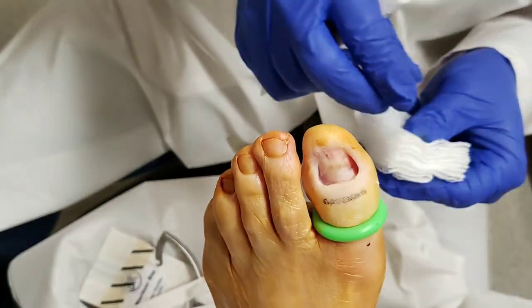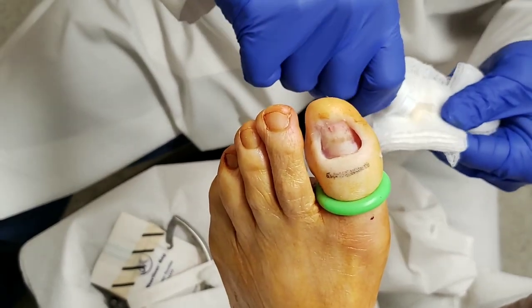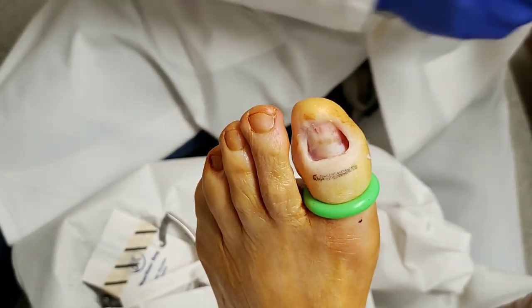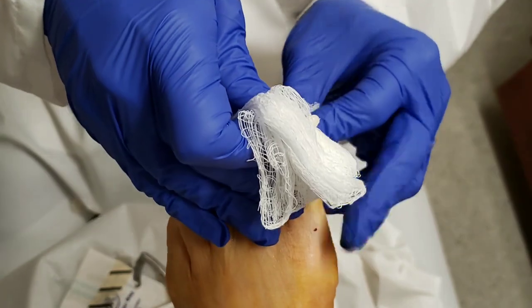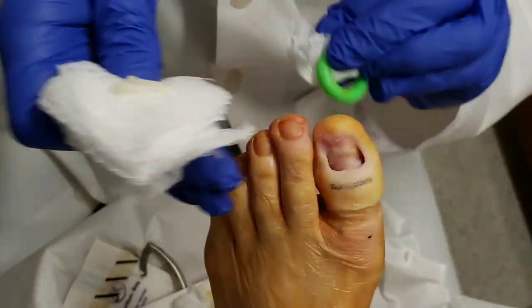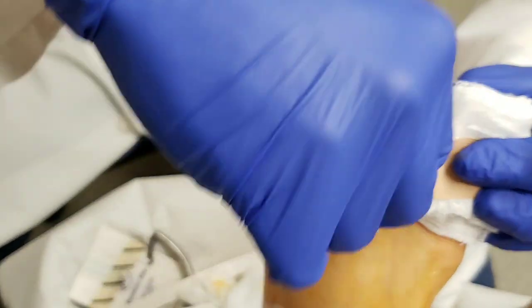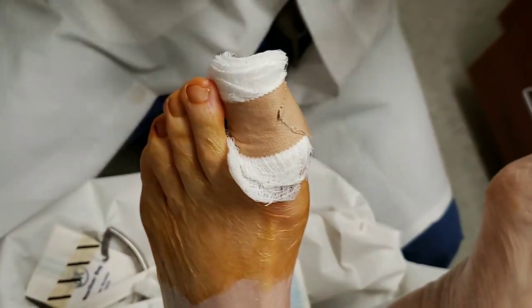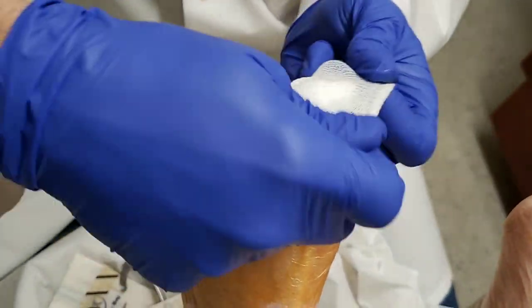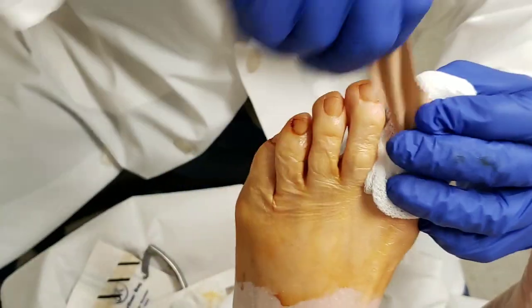Do you want to take the tourniquet off? I am — but what I've learned is I get my bandage ready first, because once I take the tourniquet off, it starts to bleed. So what I do is I try to take it off quick, and that's why they make them green, so you don't forget them. And then I put on a nice tight bandage. I always recommend that patients take it easy and don't do too much today. There is going to be some drainage and some redness — all those things are normal.